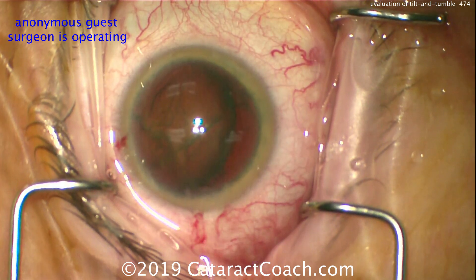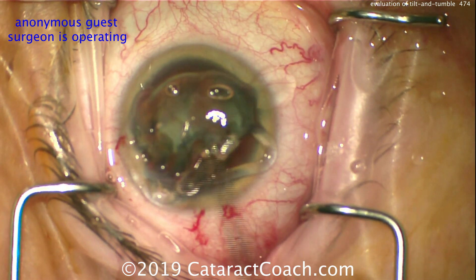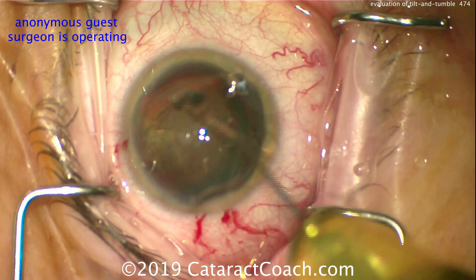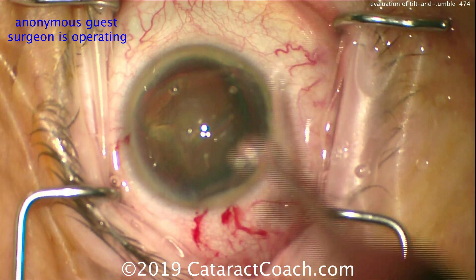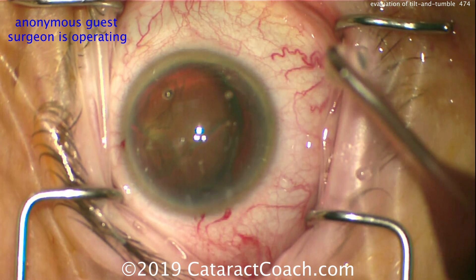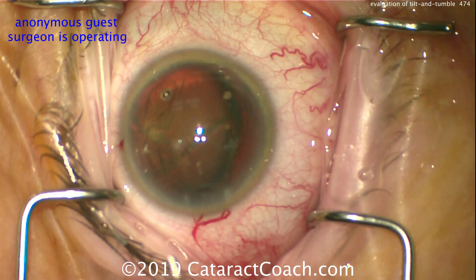We've shown videos of this here on Cataract Coach. For a relatively soft nucleus, it's extremely efficient — we certainly had a sub-five-minute case. Tilt and tumble definitely works well for a soft lens. Here's some dispersive viscoelastic going on top of the cornea and now being squirted with some balanced salt solution. That'll help keep the surface of the eye nice and wet, and you don't have to squirt as many times. Here comes the FACO probe.